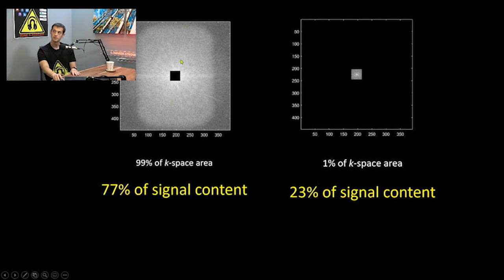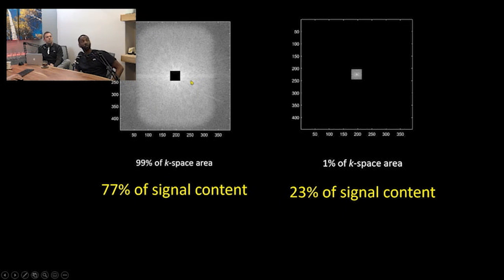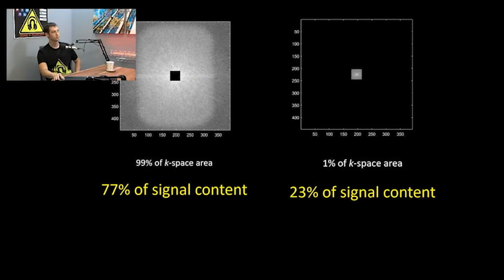Why do you think the up-down in this case is the frequency encode? Is that square? It's close. Actually, that's correct. There are more k-space pixels in this vertical direction than in the other, so it goes to quite 400, and it goes to 450 here.